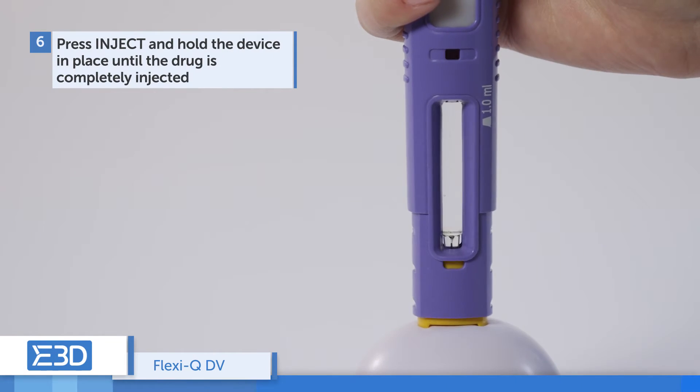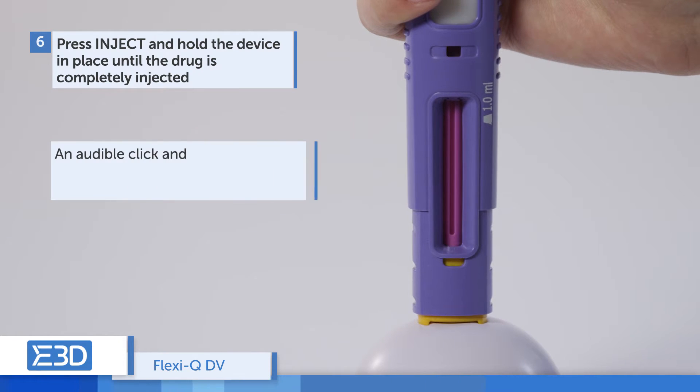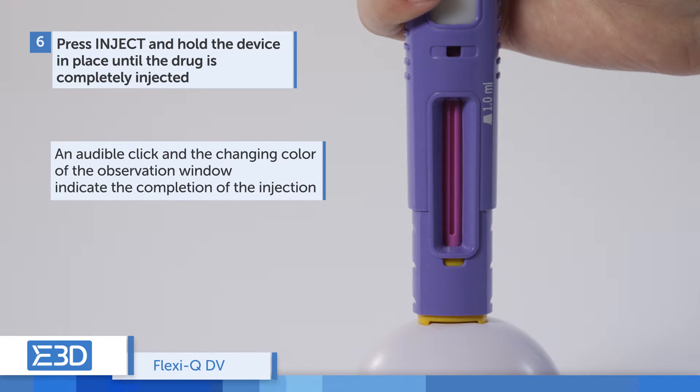Hold the device in place until the drug is completely administered. An audible click and the changing color of the observation window indicate that the injection is completed.